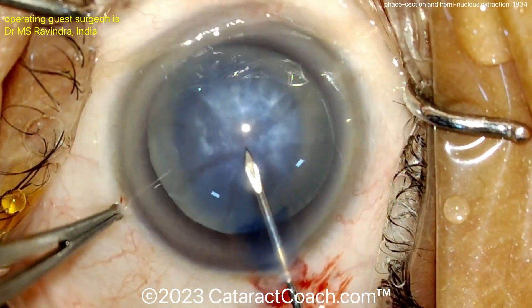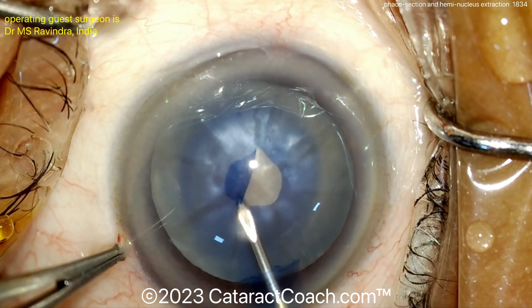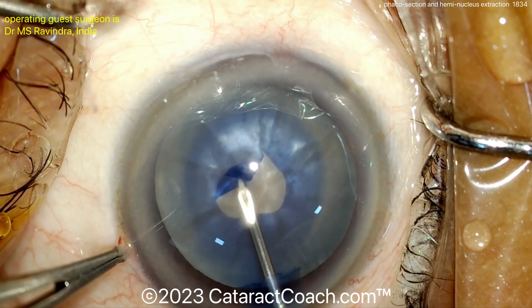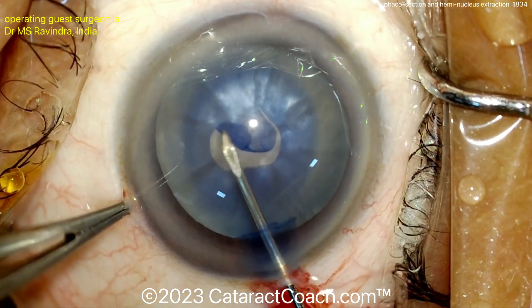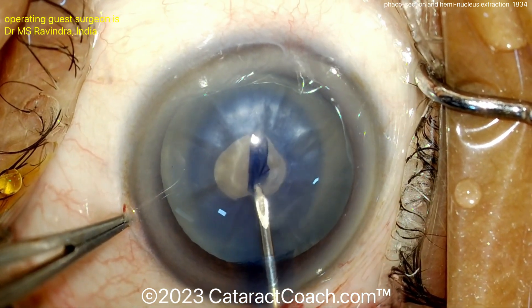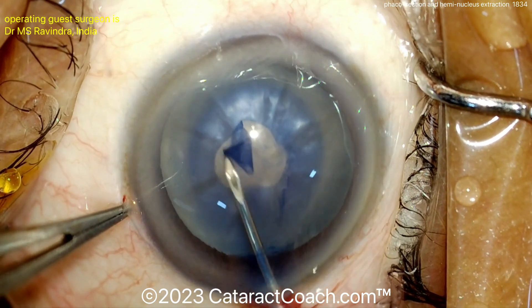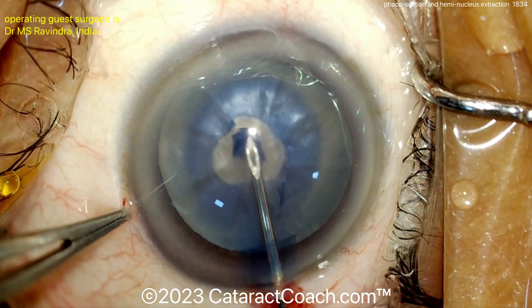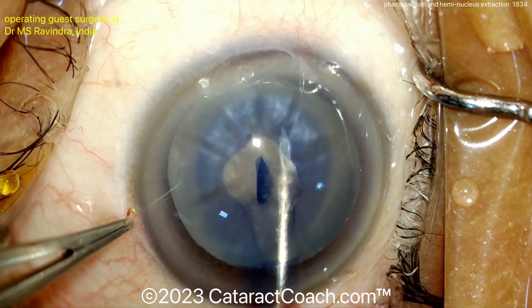this surgeon is going to split the nucleus into two halves in the anterior chamber and then remove each hemi-nucleus out of the incision. You can see here getting the rexis done — looks like a nice dense cataract. But not too much intumescent fluid there. You can do a baby rexis first, so here comes that little baby rexis, and then decompress the capsular bag — this is the double rexis technique.